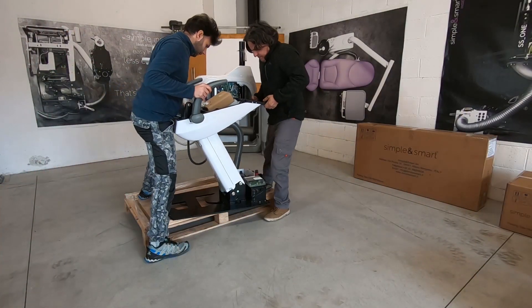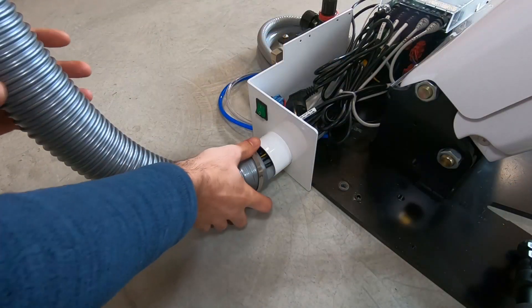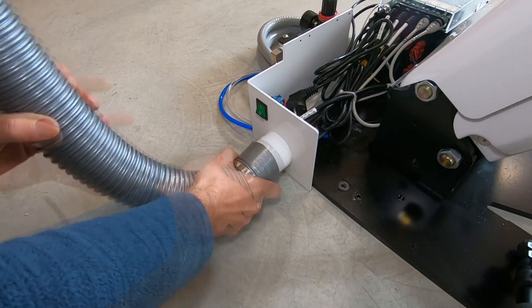Remove the dental unit from the pallet. Fix the cable and pipes tube to the chair base.